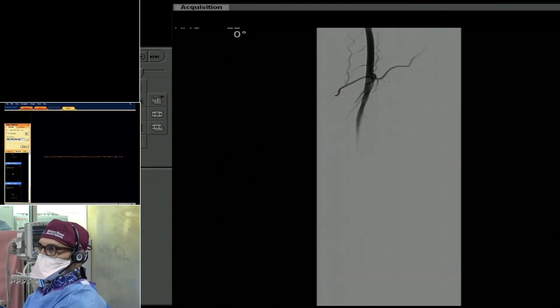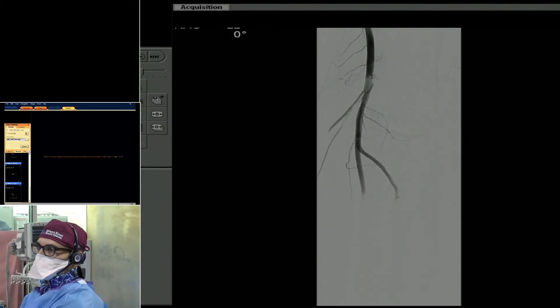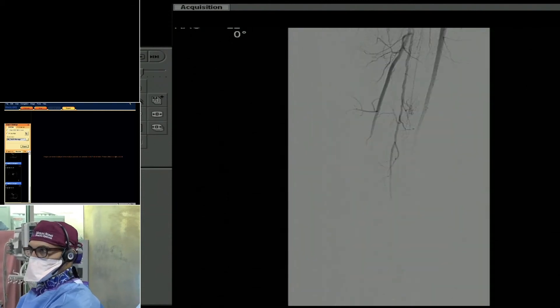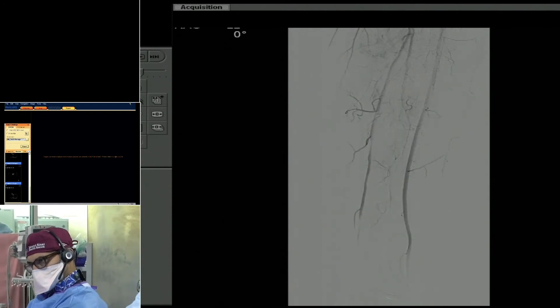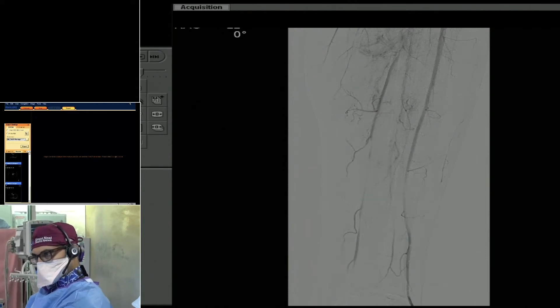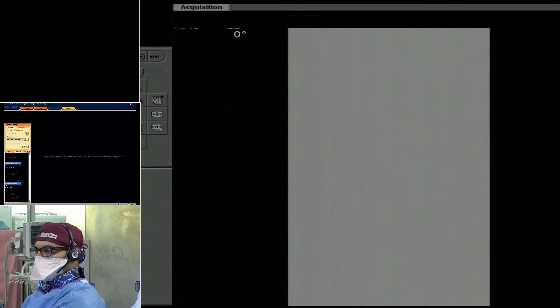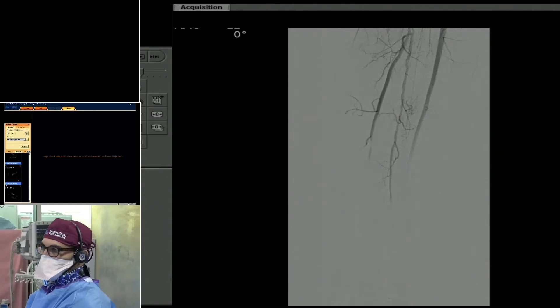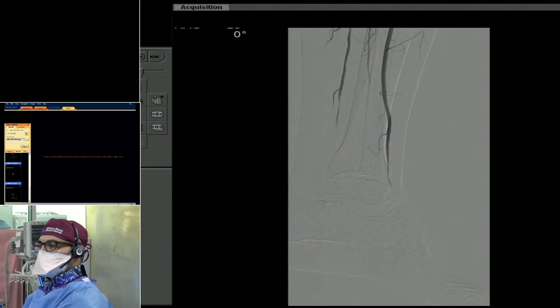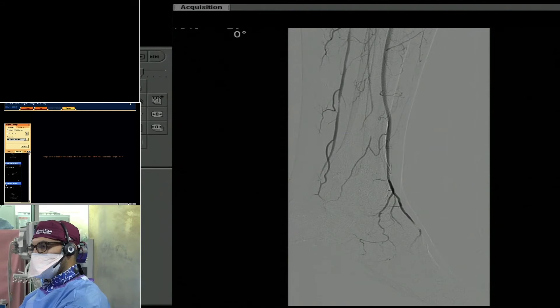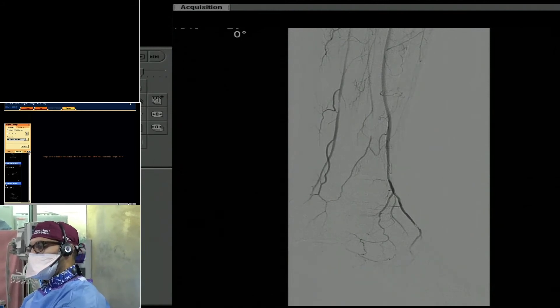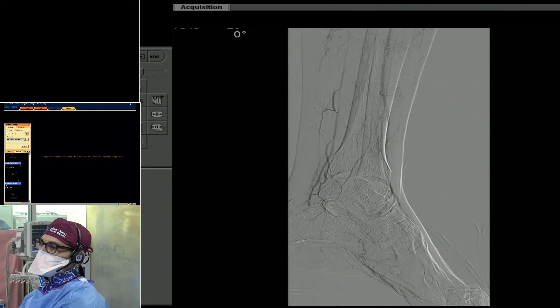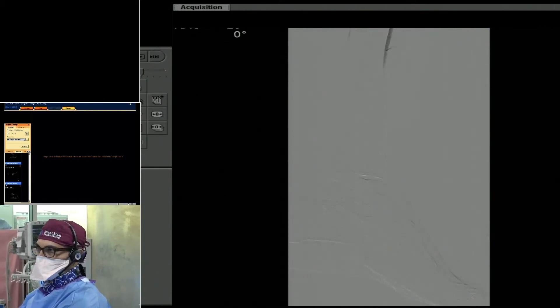Now that we've crossed the lesion, we re-imaged and we can see all the vessels are widely patent. However, there's severe inflow obstruction and poor filling as a result of the inflow problem. It's quite interesting how severely the inflow is restricting this. The question for the panelists is: given this runoff, would you consider CSI atherectomy — which is really the only atherectomy device that can reach this lesion — versus primary angioplasty and stenting of that severe SFA lesion?